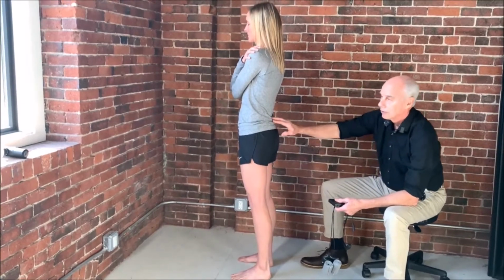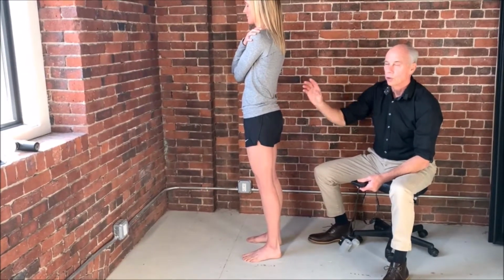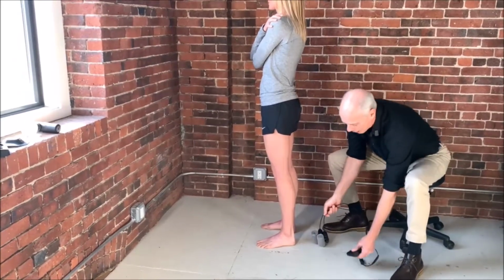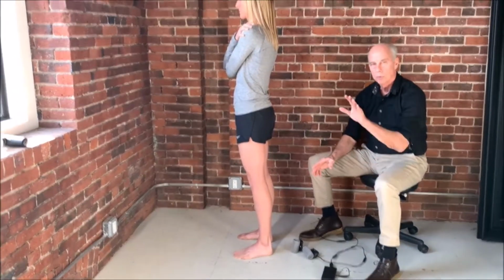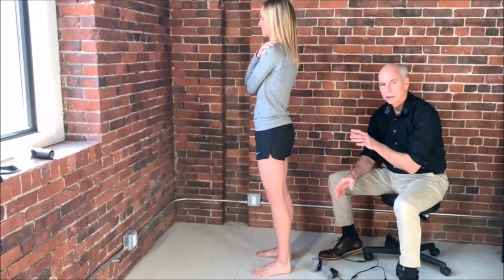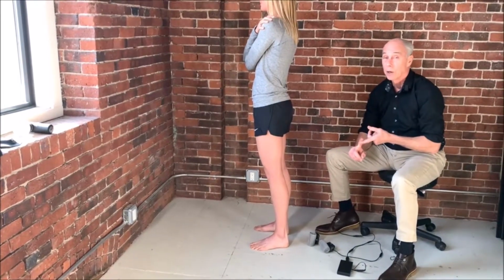So these researchers figured out that if you have impaired spindle activity, you're going to get hurt because muscles don't know where they are in space and they're more likely to be strained. So they put these little motors on the backs of people's calves. The first study, they took a large number of people who had low back pain and those who didn't, and using this test they were able to successfully distinguish between low back pain patients and non-low back pain patients. That's a big deal because MRIs don't do that, x-rays don't correlate well with back pain.